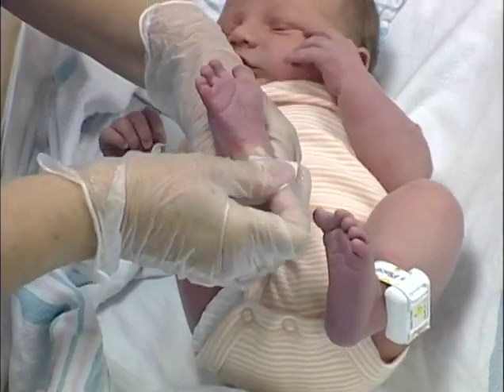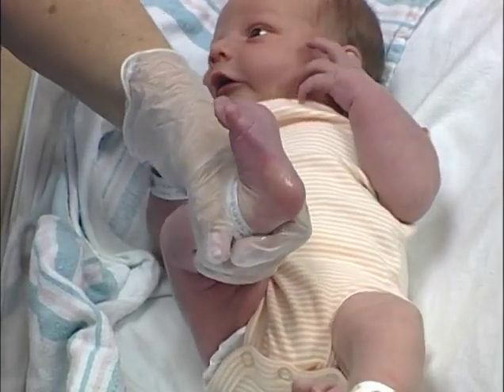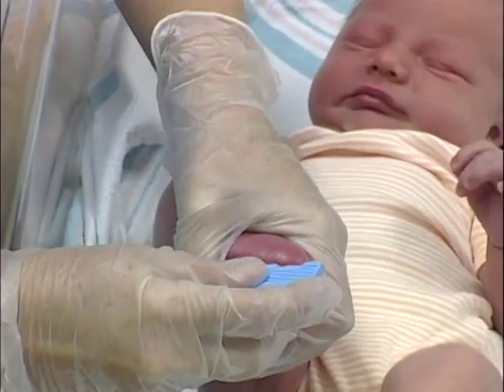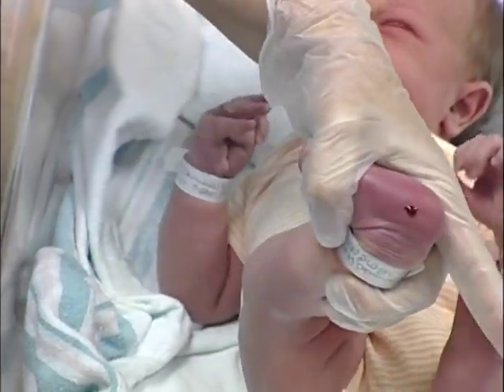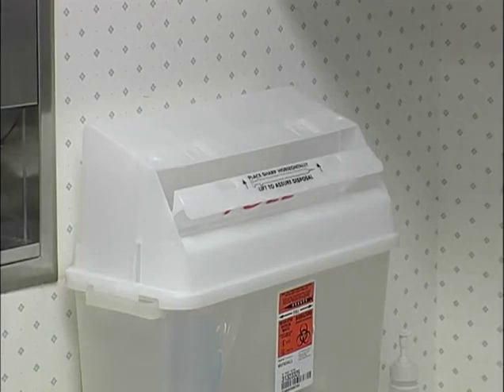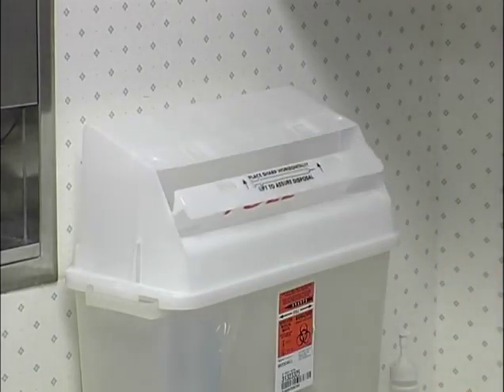Thoroughly cleanse the site with an appropriate disinfectant and allow to air dry. Do not blow on the site. Place the puncture device on the cleansed skin without compressing the tissue and activate the device according to manufacturer's instructions. Dispose of the device according to OSHA guidelines and your facility's policy. Performing a second puncture or double sticking is against the standards and should not be attempted.